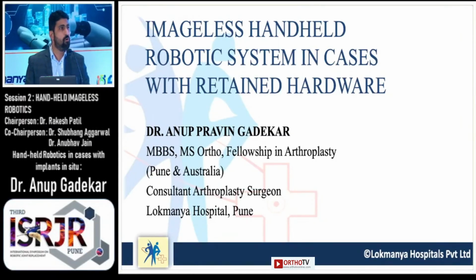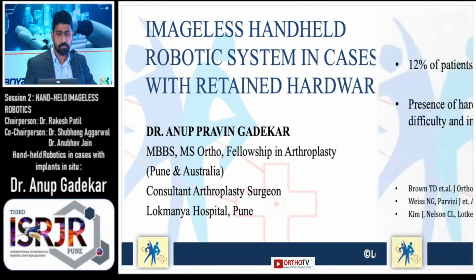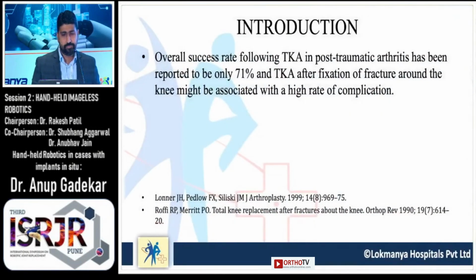Actually, my talk falls under complex cases in arthroplasty, which is retained hardware, and we must all agree that this is a challenging case scenario for any arthroplasty surgeon. Now, 12% of patients undergoing total knee arthroplasty suffer from secondary osteoarthritis, and the presence of hardware in knees undergoing TKA causes technical difficulty and increases the risk of post-operative complications.